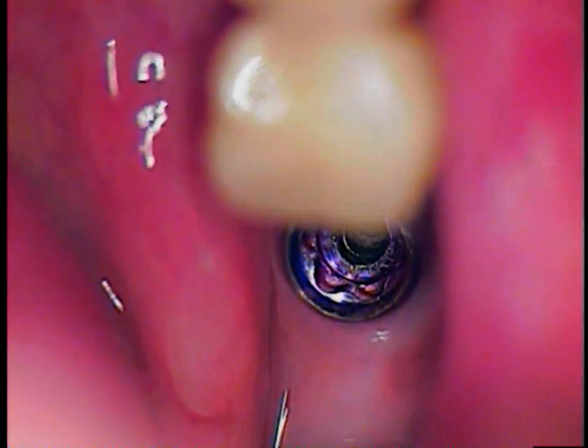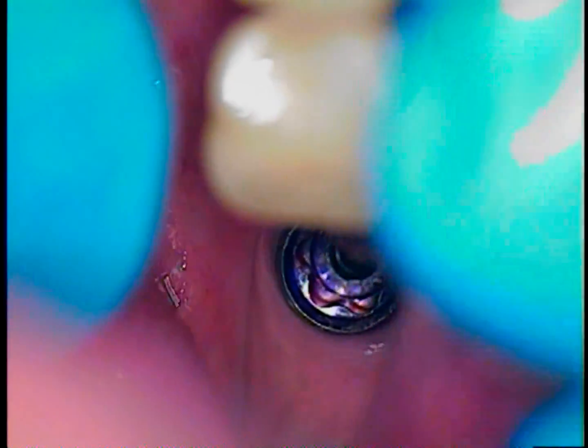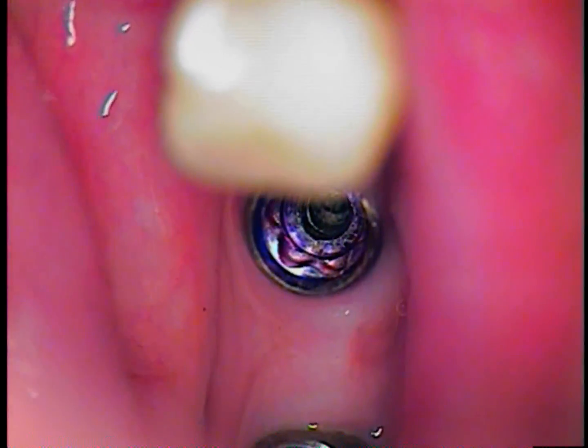So we're looking again to go in now with the driver. And the key is to push as hard as you can down to try to get as much contact of metal to metal as you can, and then make the turn to the left. So it's counter-clockwise. If you don't push down hard on the driver itself, it'll slip and then you'll end up just removing metal from the slot, and that would just make it counter-productive. So there's no device that can actually press this. You just have to use your thumb and press it in place.